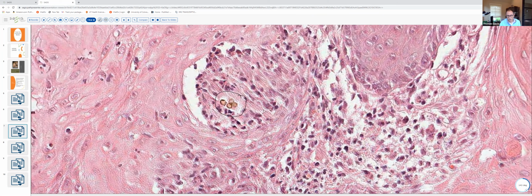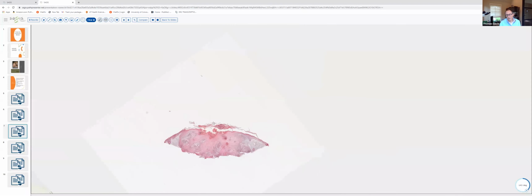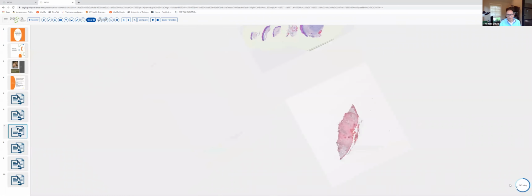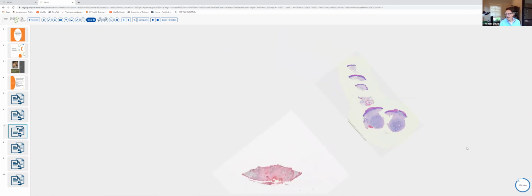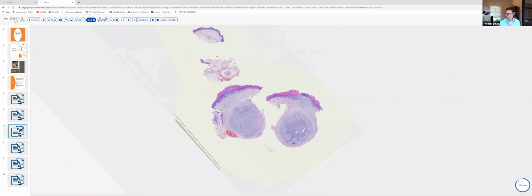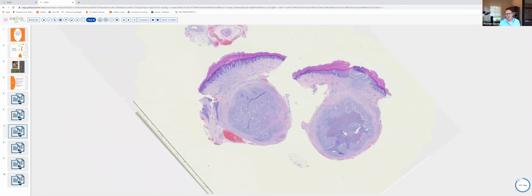So let's go ahead and move over and take a look at our Phaeohyphomycotic cyst by comparison. Bear with me, I'm going to flip the slide. And in this particular biopsy specimen, you can see that the infiltrate is present deeper in the dermis. And typically we see nodular collections of histiocytes and neutrophils deeper in the dermis or subcutaneous tissue surrounded by fibrosis. And of course, clinically, the patients tend to present with deep dermal or subcutaneous nodules. This histology is very characteristic.